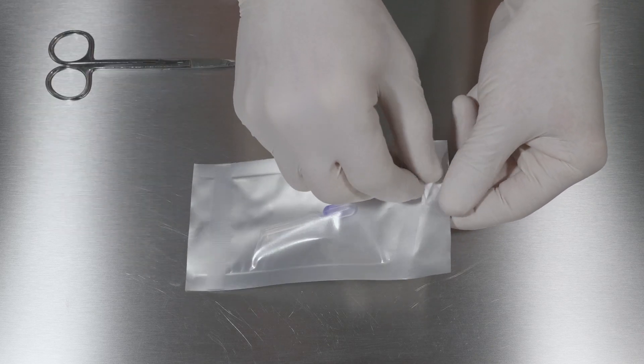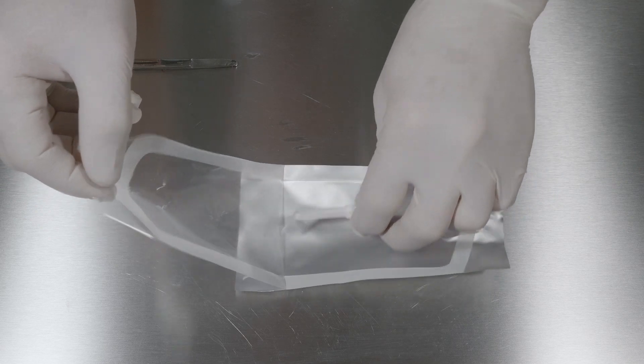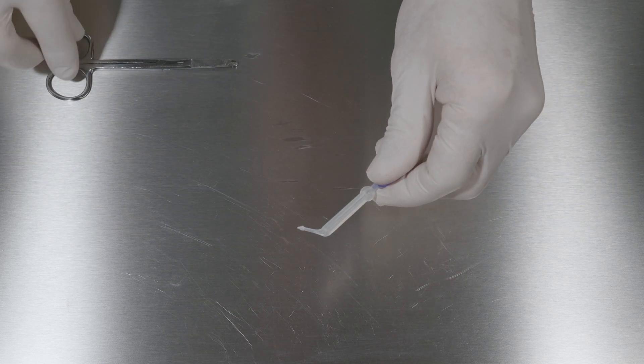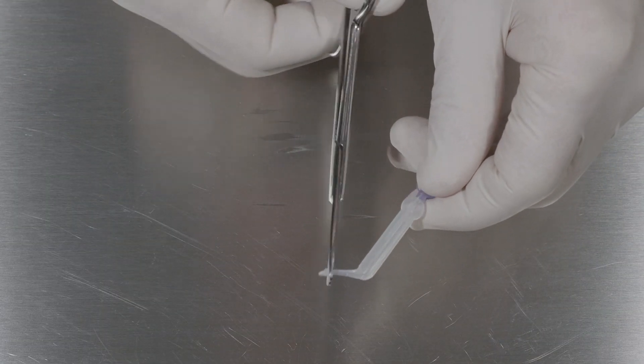Open the pouch that contains the sterile single-use pipette. Use a pair of scissors to trim the tip of the pipette in order to prepare it for use.